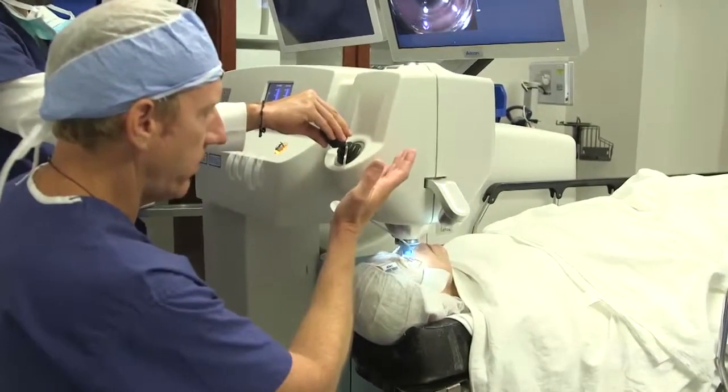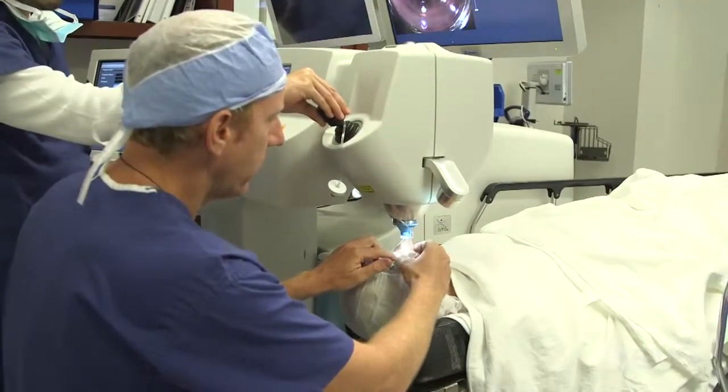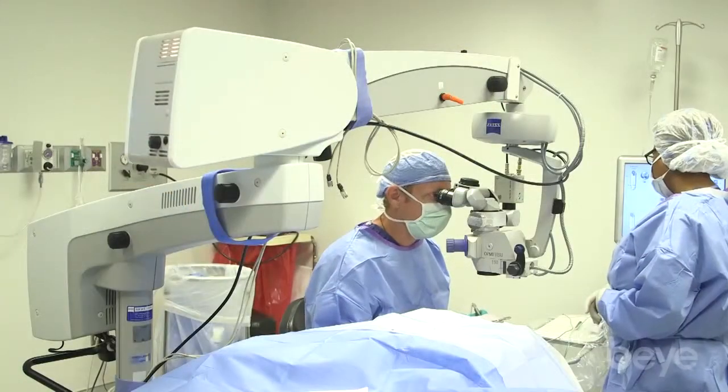Using the joystick, we lift up the gantry, take the lid speculum out, and move the patient into the operating room for the cataract surgery.